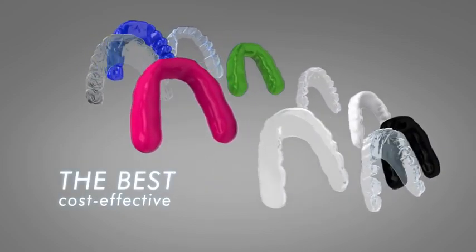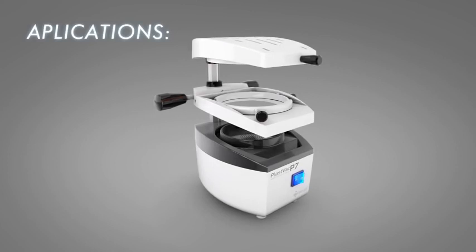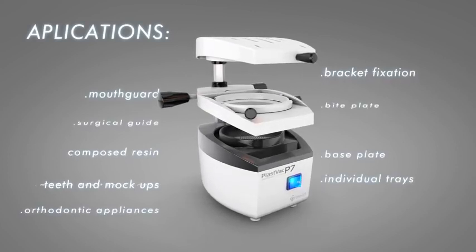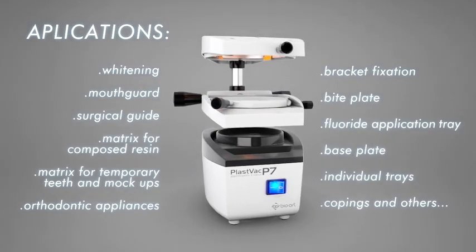With approximately 30 sheets, you recover the investment. The PlastVac P7 will turn your dental office or lab into something much more versatile. It can be used in more than 15 applications.